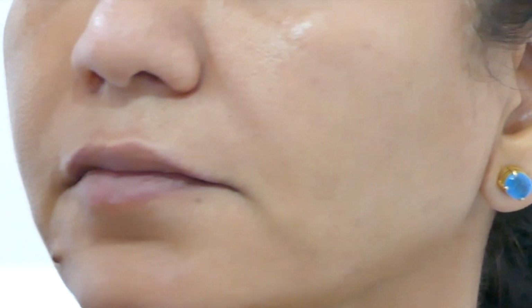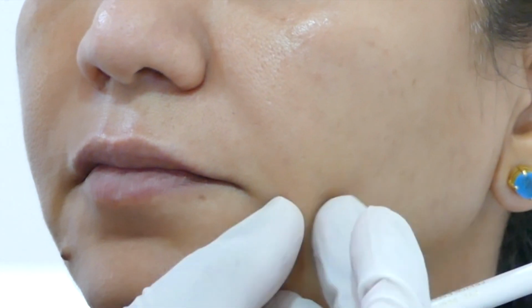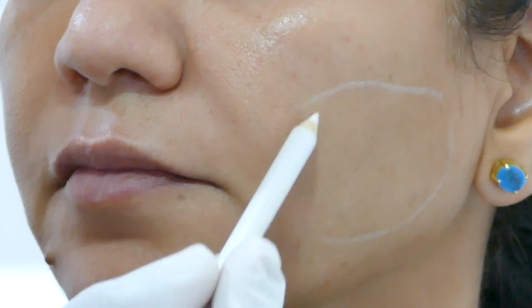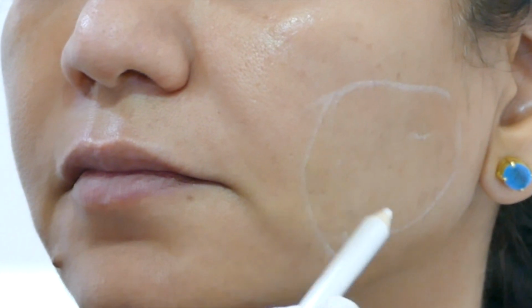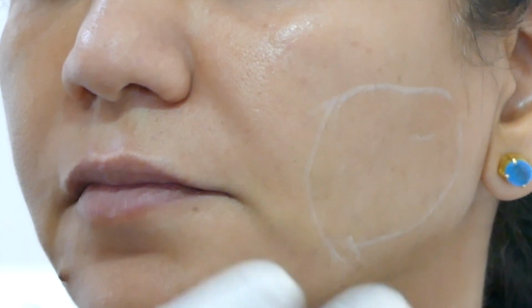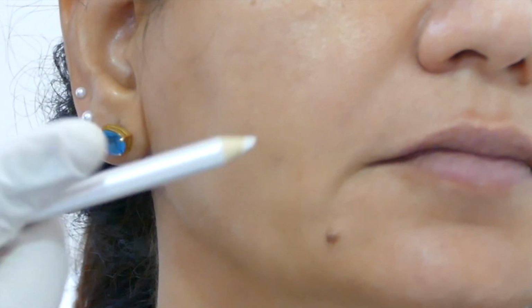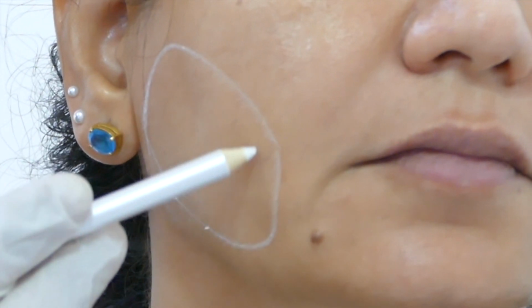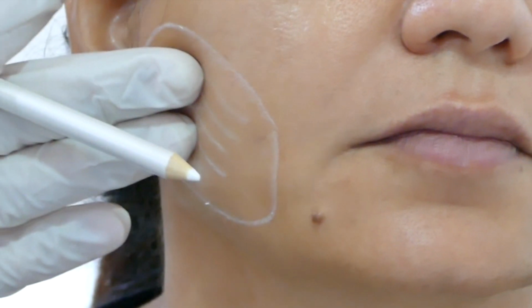Second area we're going to improve is, you can see the lower part of the face where there's a little bit of laxity here. So I'm going to do fillers in this zone in the cheek area to get some tightening. This is more of biostimulation, so we get some tightening. It is not volume enhancement. Same thing on this side. Just to lift this up, I will inject fillers in a very superficial layer in this place to get the lift.